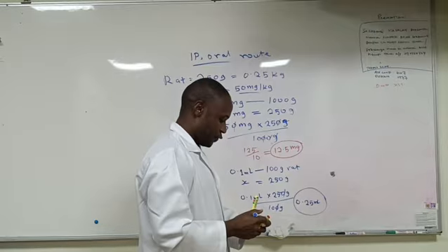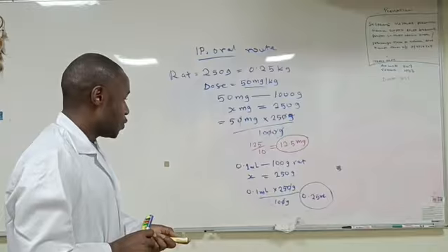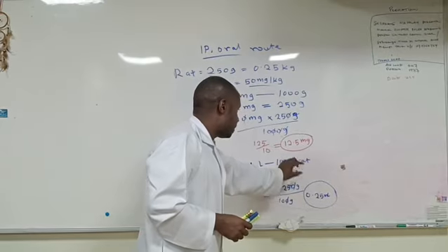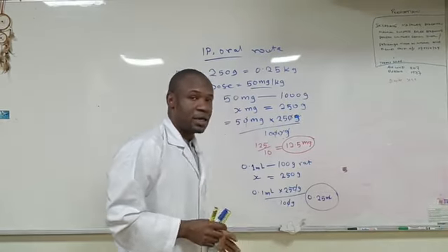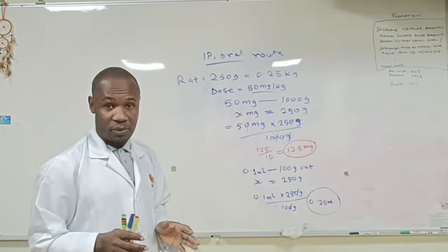So what this means is that you use 0.25 ml of your diluent, could be normal saline, could be DMSO, could be Tween, depending on the compound you are going to administer. Then you just use this to dissolve this particular drug or compound, then you now administer it intraperitoneally. While administering intraperitoneally, there are so many things to be considered.